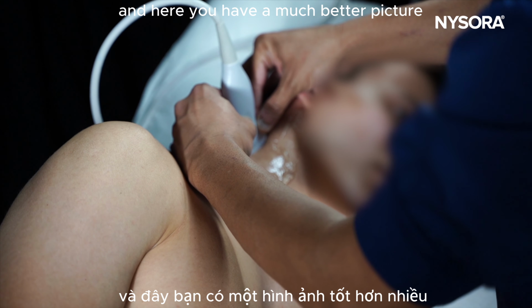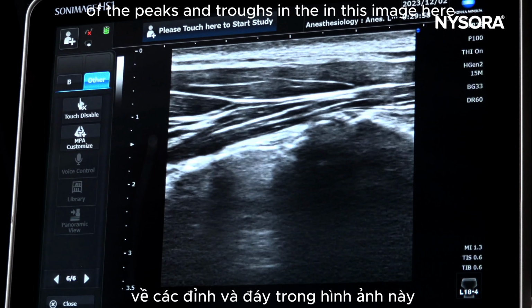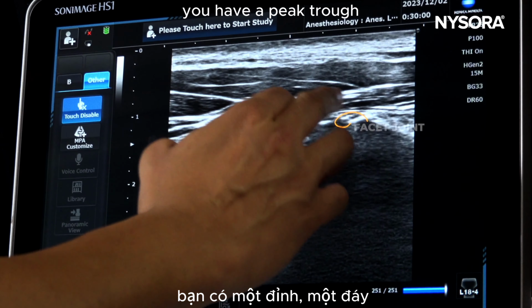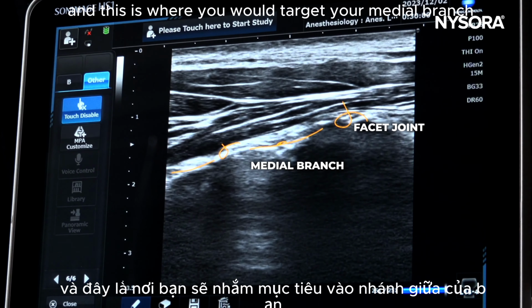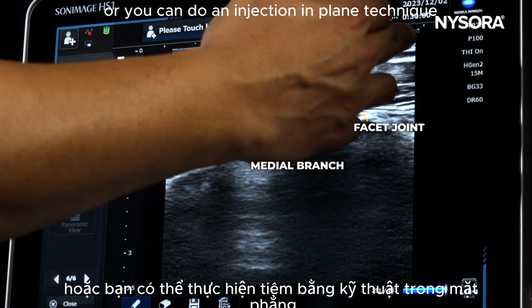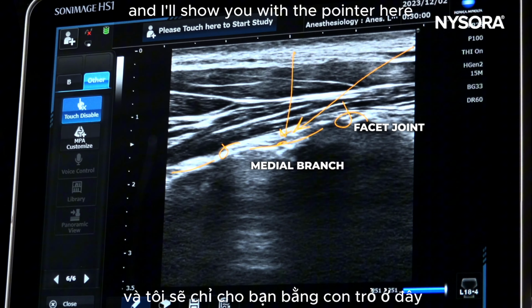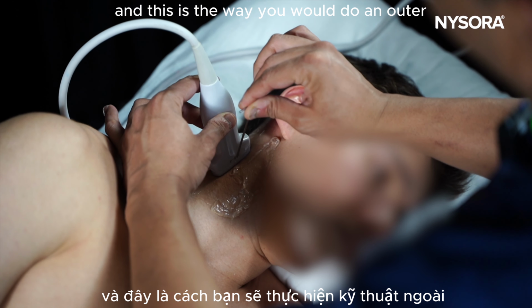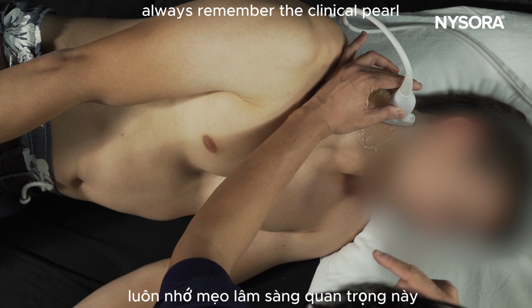And here you have a much better picture of the peaks and troughs in this image. You have a peak, trough, and this is where you would target your medial branch. Now you could do the injection in an out-of-plane technique, or you can do an injection in-plane technique from superior to inferior, or cephalad to caudad, and I'll show you with the pointer here. So this is the way you would do an in-plane technique, and this is the way you would do an out-of-plane technique.